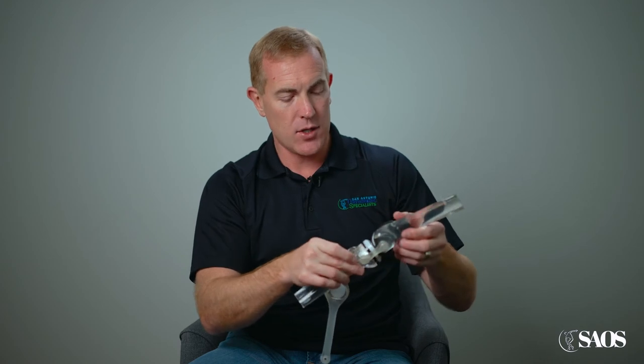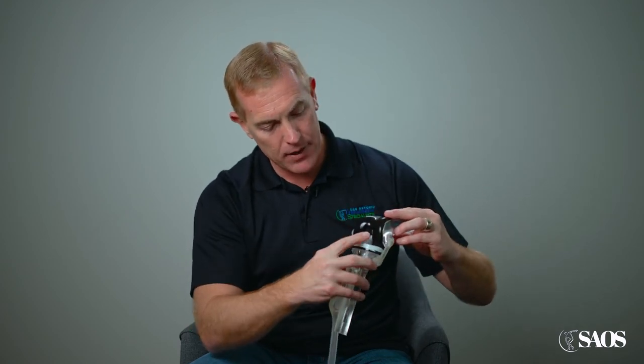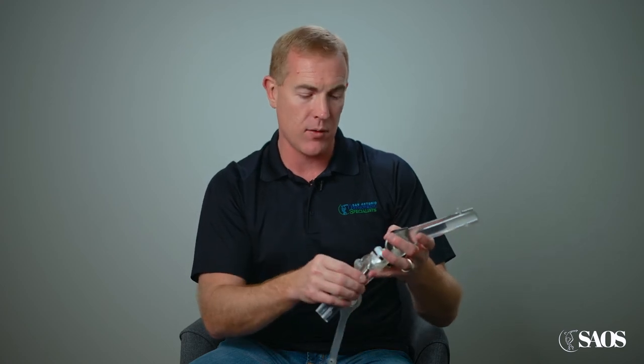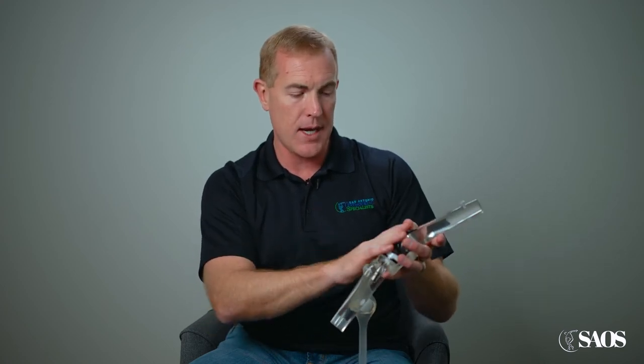Just looking at this model, you can see that when I bend the knee back it pivots here instead of just going straight up and down, and that's because of the design of the implant — our normal knee functions just like that.